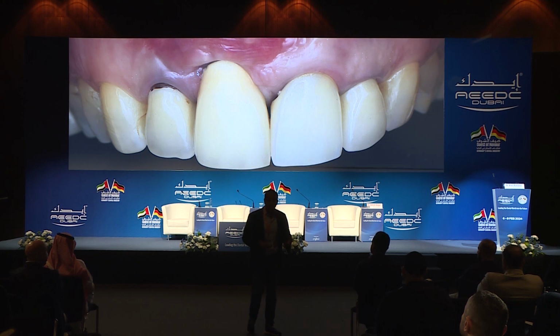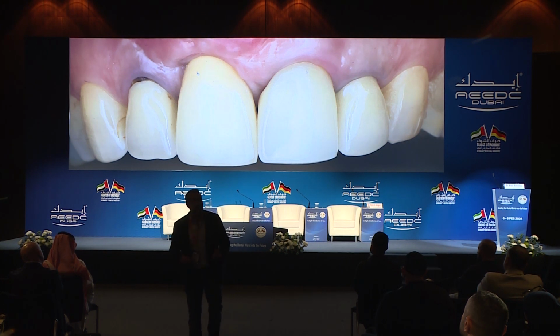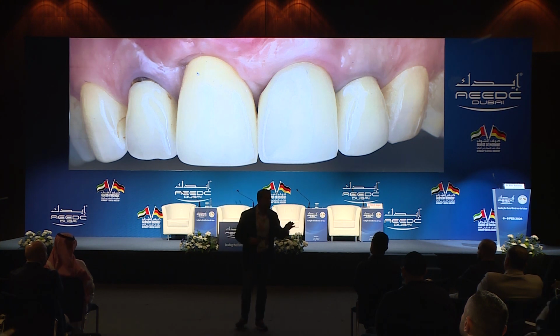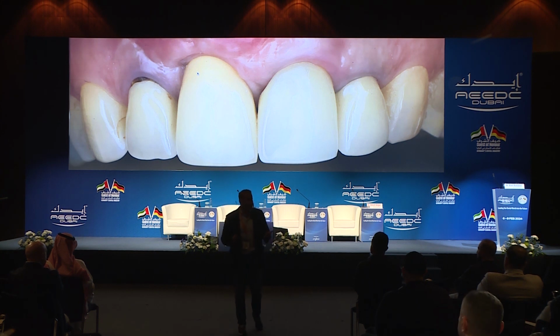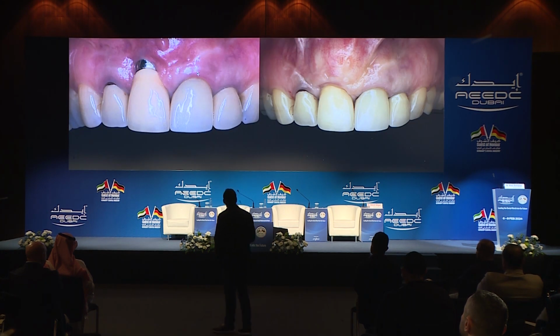Now, if you look at the studies today, this is a recent study that talks about buccal implant placement. My friend, if you place your implant too far to the buccal, there is 14 times more chance that you will have a buccal implant recession. So why place the implant too far to the buccal? Just place it in the safe green zone. And this is the case, before and after.